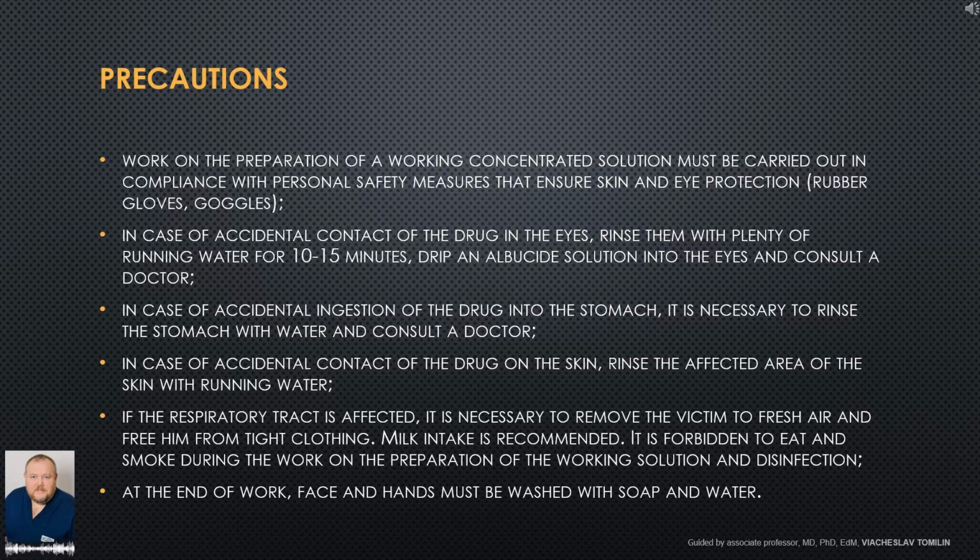It is forbidden to eat and smoke during the work on the preparation of the working solution and disinfection. At the end of work, face and hands must be washed with soap and water.